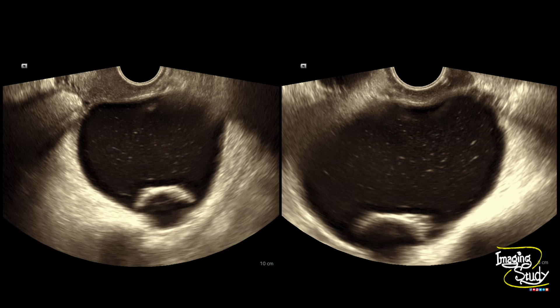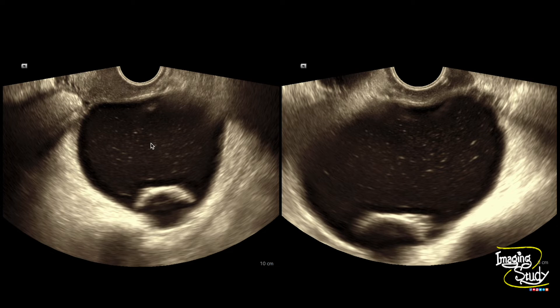Here's another image showing the cystic lesion at the left adnexa with the internal dot-dash pattern and a calcified structure casting a little acoustic shadow.